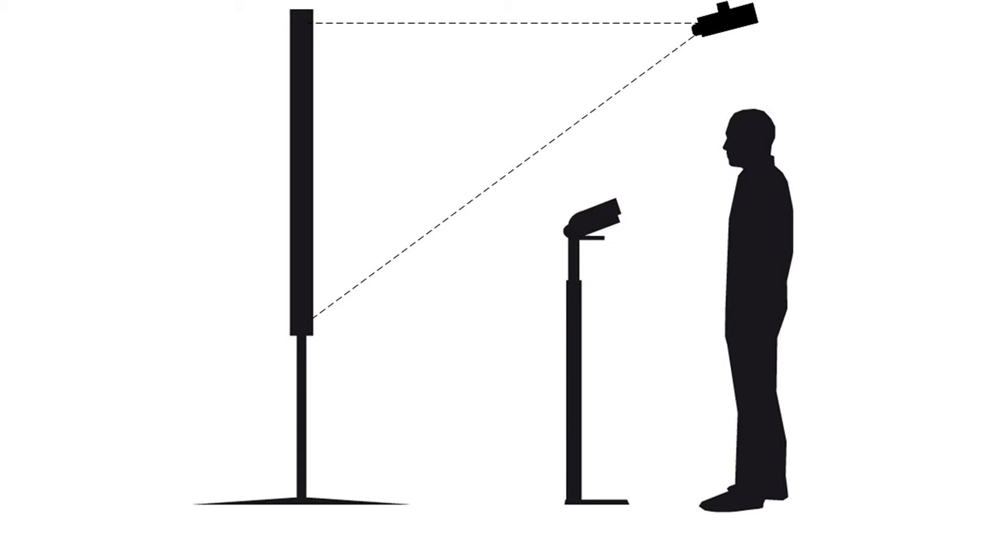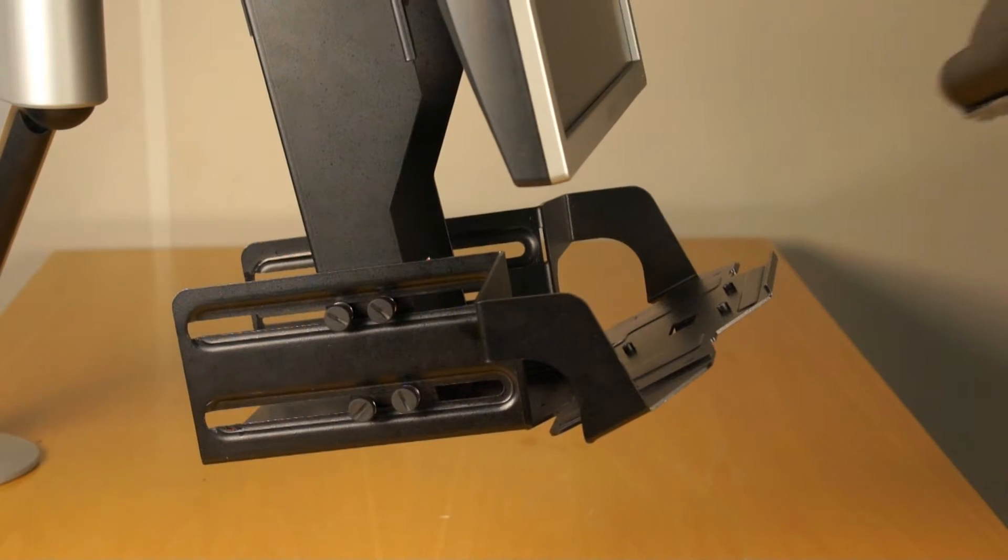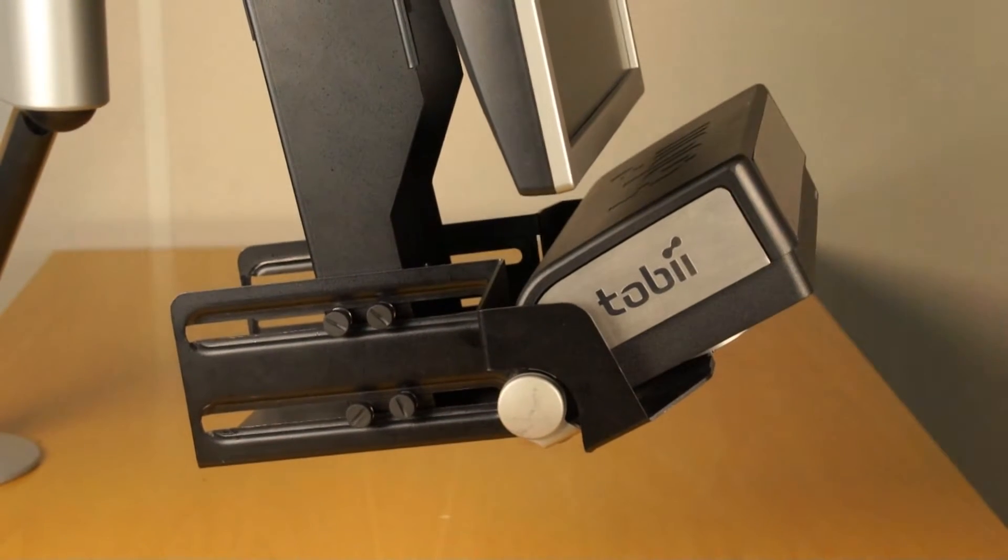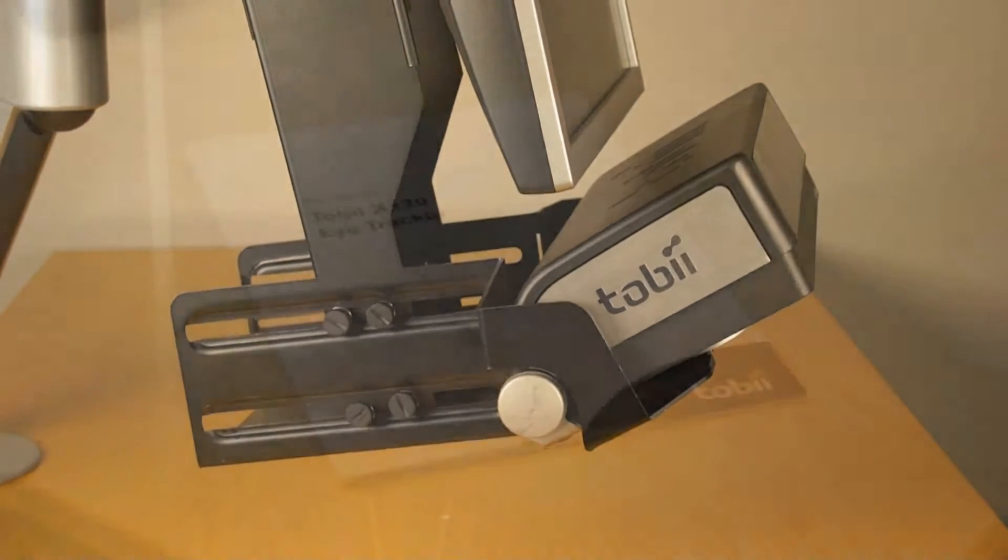Please note that this instructional video will explain the process of setting up the eye tracker by using a projected screen. The process is the same if another kind of screen is used instead.